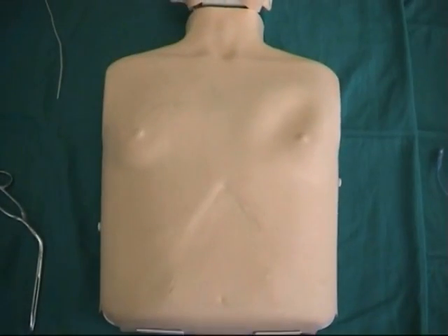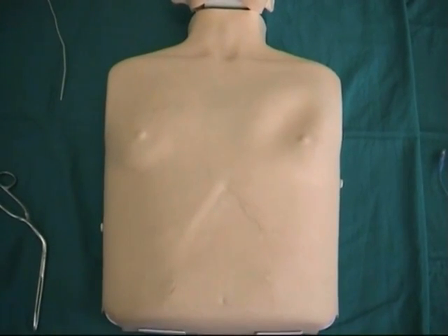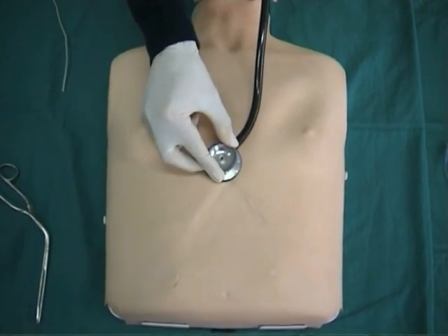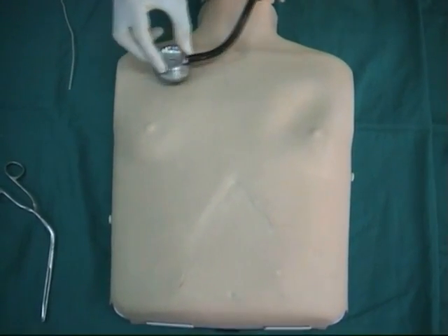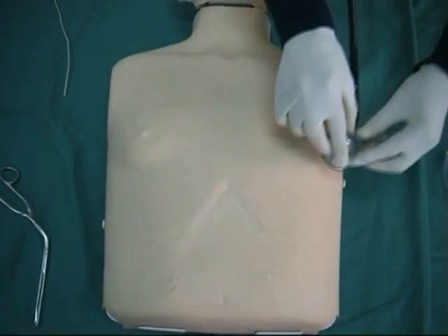We should assess for an esophageal endotracheal tube placement by auscultating over the stomach during the ventilation. Auscultate both sides of the chest in the mid-axillary line to assess for equal bilateral air movement.